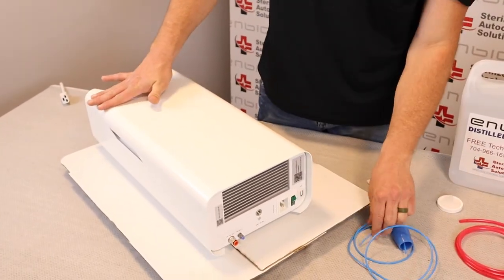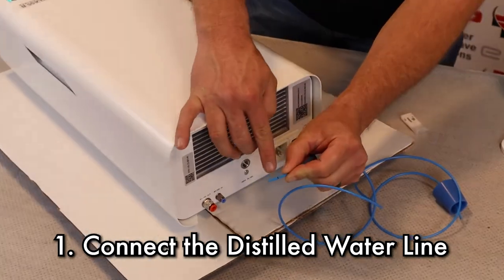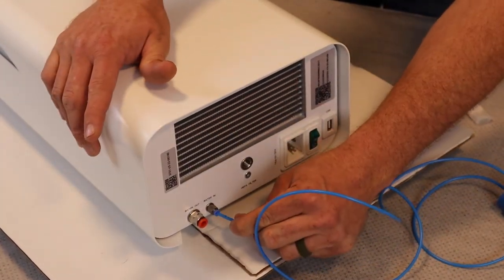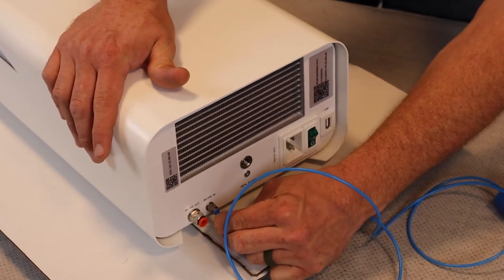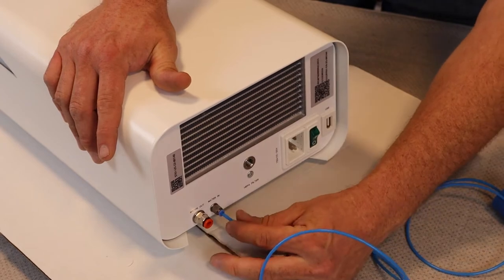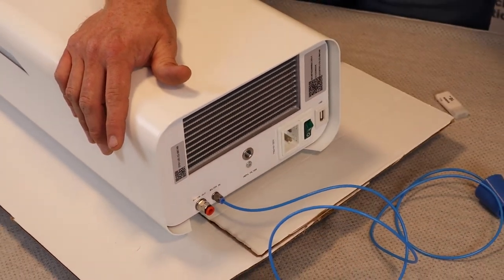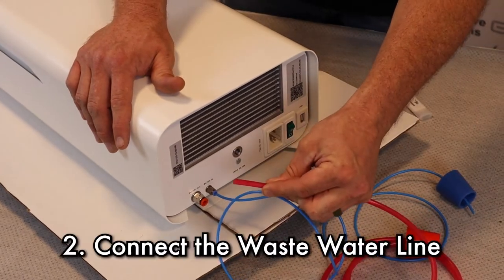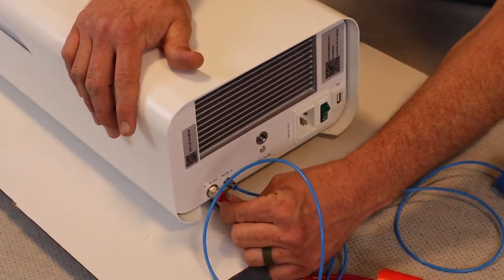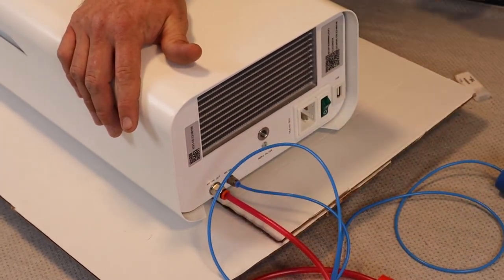We're going to start on the back of the unit with the distilled water line. The distilled water line has a black mark about a half inch in. You want to make sure that black line is almost touching the base to be fully inserted. Once that's in, give it a little tug to make sure it does not come out. We're going to do the same with the wastewater line — make sure that black line is touching the base, then give it a little tug to make sure it's fully inserted.